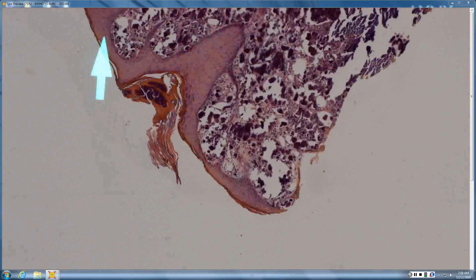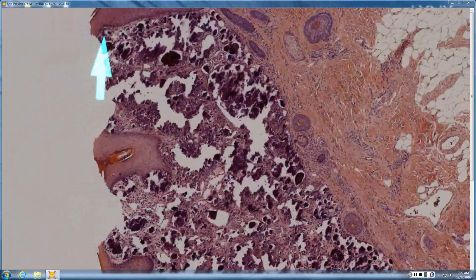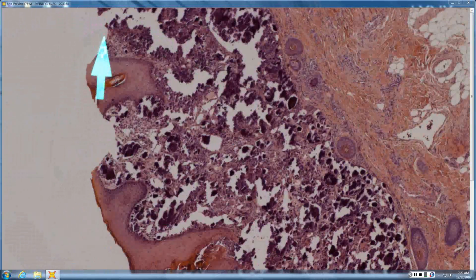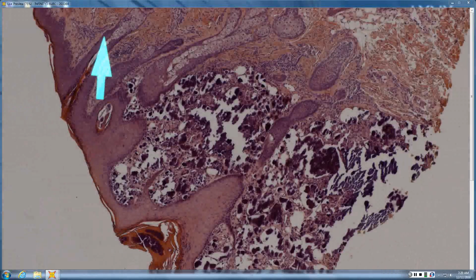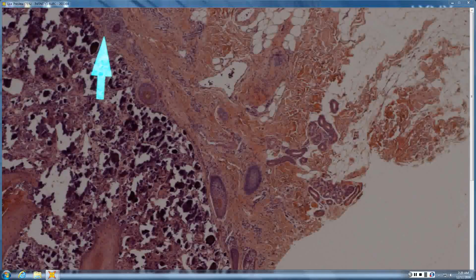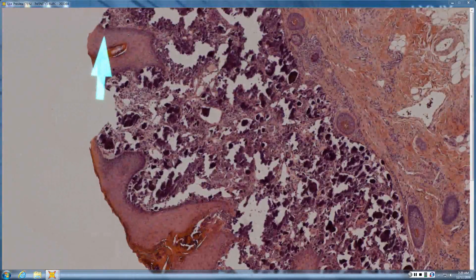So what's the patient population and site that you're usually looking to see this? Heel of the newborn or chin of a child. Pretty specific. Very few other things kind of look like this. So, any other questions? So subepidermal calcified nodule.